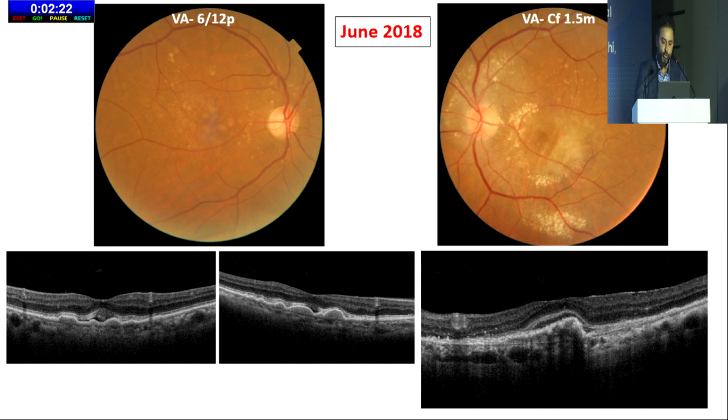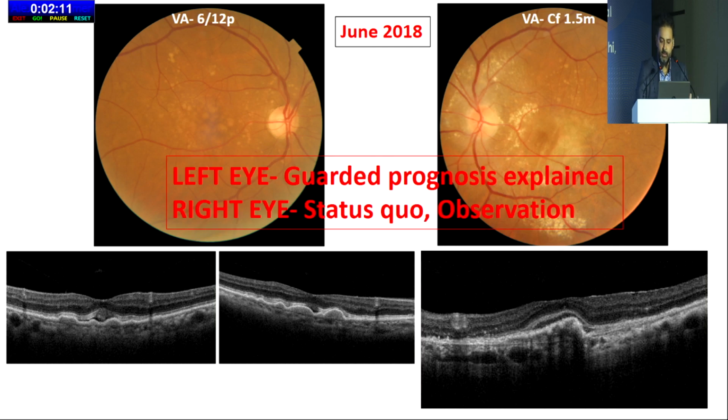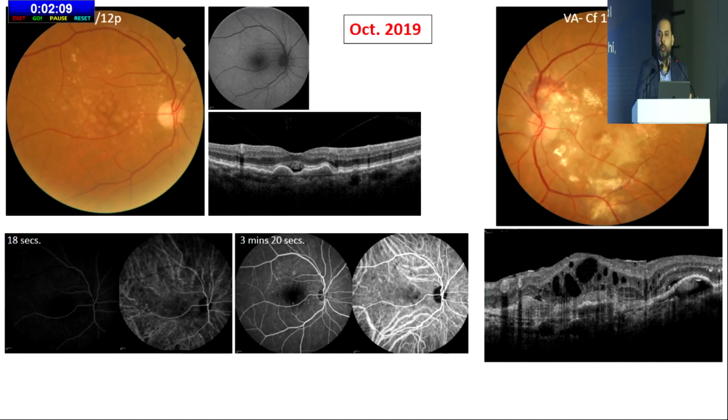still, mind you, only subretinal fluid, not intraretinal. The left eye is remodeling after the insult to the ripped RPE, observed. Same thing. This is 1 year later, 2019. We started March 16, so we are into a 3.5-year follow-up. Right eye status quo, absolutely similar.